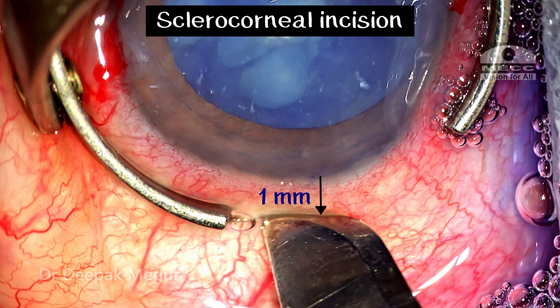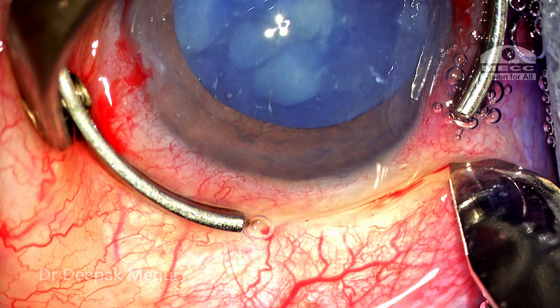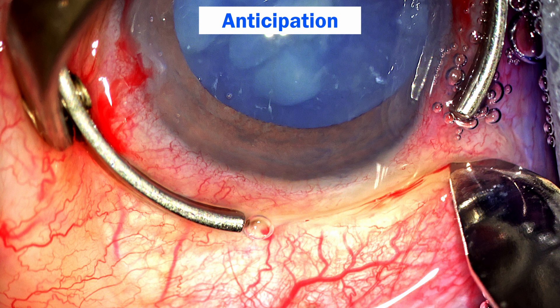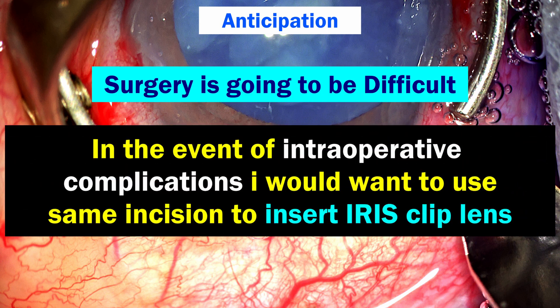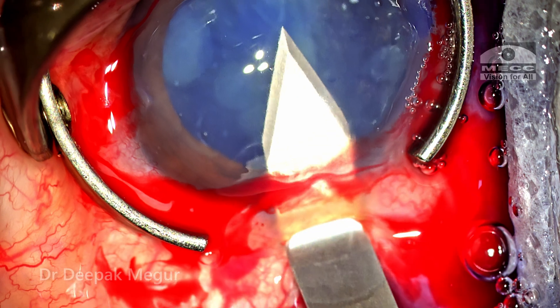The scleral incision is about 1 mm posterior to the limbus. Let me explain my thinking behind this incision. I'm anticipating a difficult surgery — in the event of an intraoperative complication where I could lose the bag, I would want to use the same incision to insert an iris clip lens, which is a PMMA lens, and the incision would need to be bigger. A scleral incision is always going to be safer, and that was the thought process behind choosing a sclerocorneal incision.